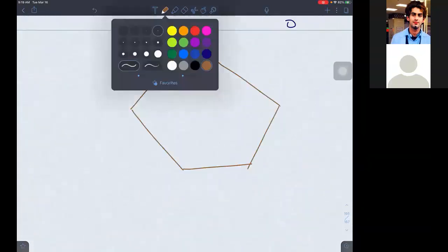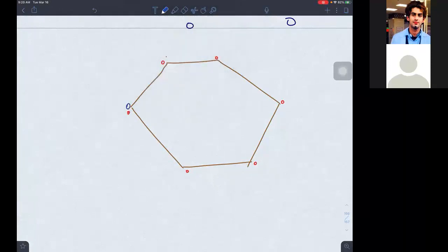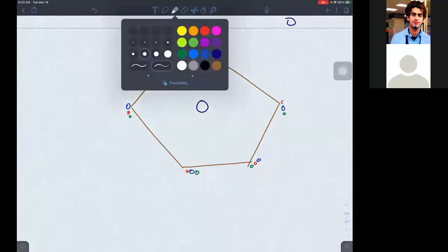And centrally we have a central vein. Now let us draw some zones.